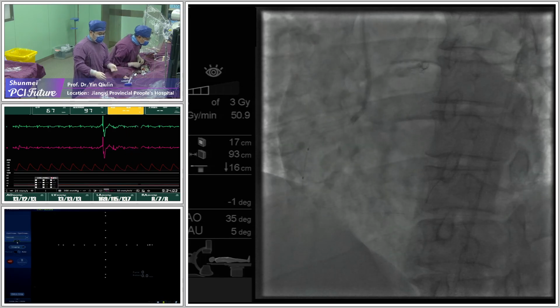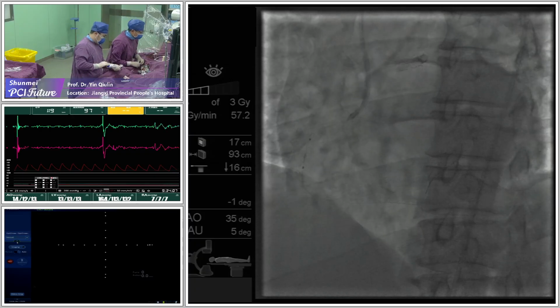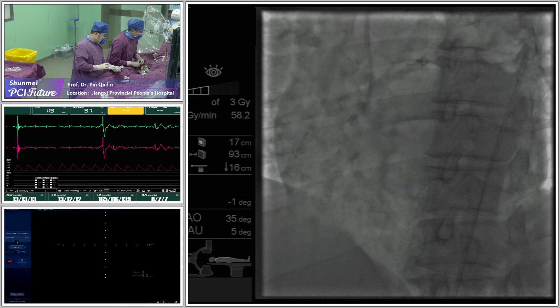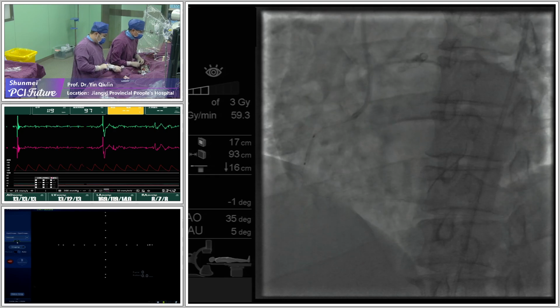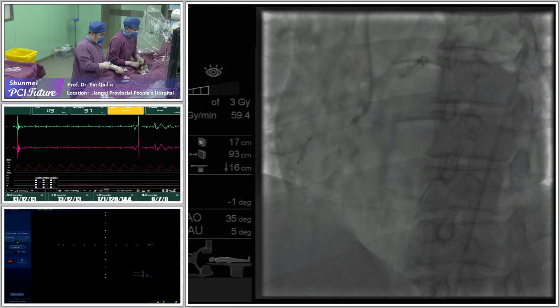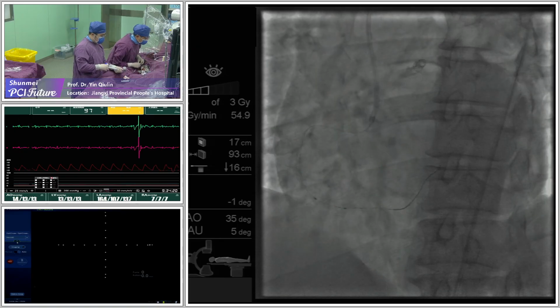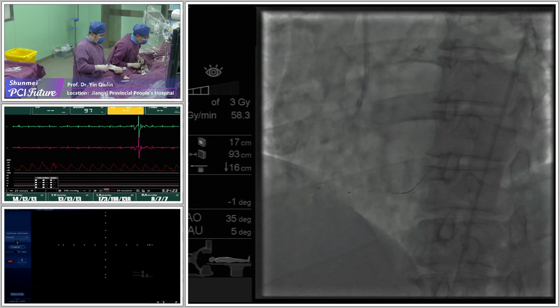Is your wire going further, Korhan? Because this is a much better position indeed. Yeah. I think it is in the beginning subintimal, substent, and that might be a possibility inside the stent. Yeah. Because the microcatheter is not going forward, you see that he's bending. He's bending there.